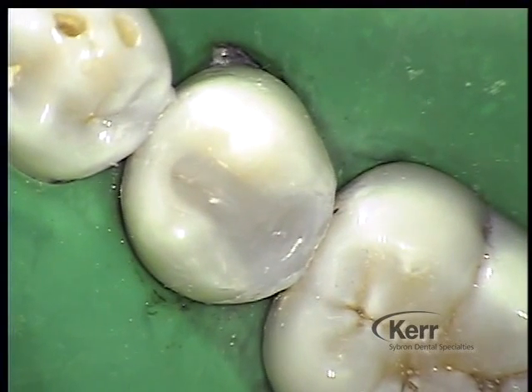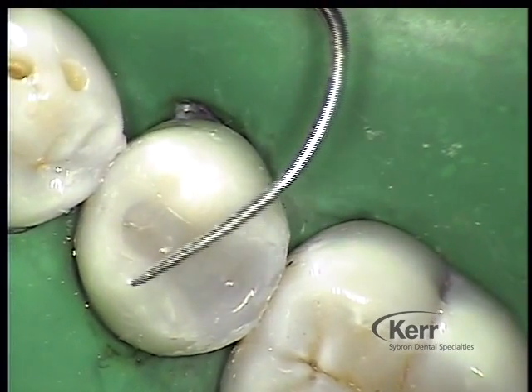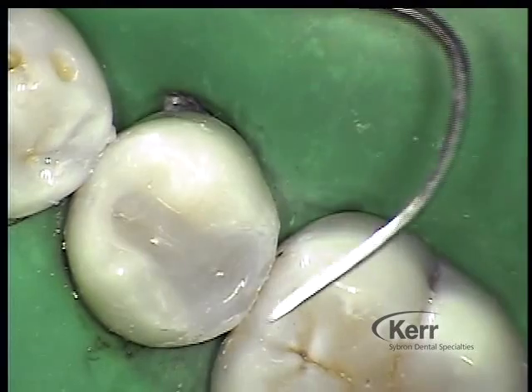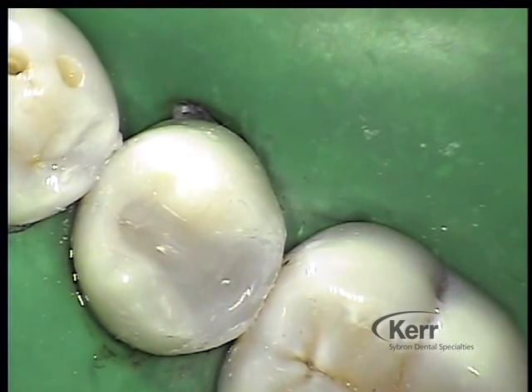Let's take a look at what we have now that SonicFill is fully cured, prior to any finishing steps or removing the rubber dam. We see a nice contact and a well-adapted composite. On purpose I etch and place adhesive beyond the occlusal surface margin because I want some flash — it's my philosophy of posterior composites. What is a sealant but nothing more than excess composite on the occlusal surface of a tooth? So if it's okay in sealants, why isn't it okay here? I look at it as just extra protection to my occlusal margin.